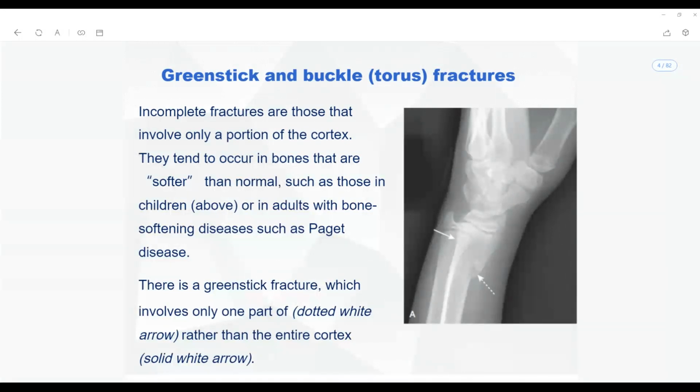For the femur, they include the hip joint. For the tibia and fibula, they include the knee joint. For the tarsals or metatarsals, they include the ankle joint. Is this point clear now? When you are looking at the bones, include the proximal joint in the x-ray.